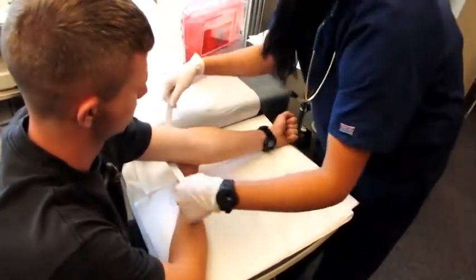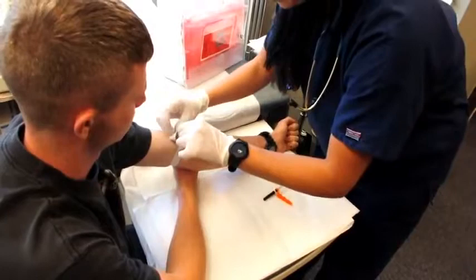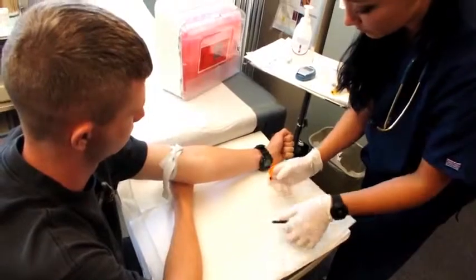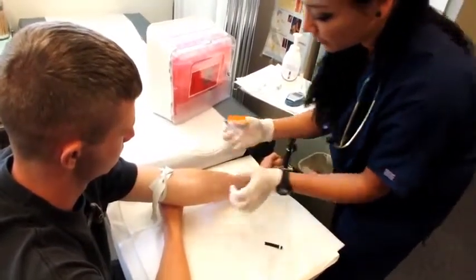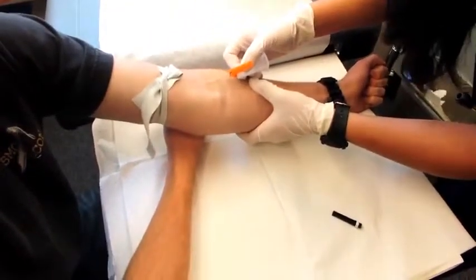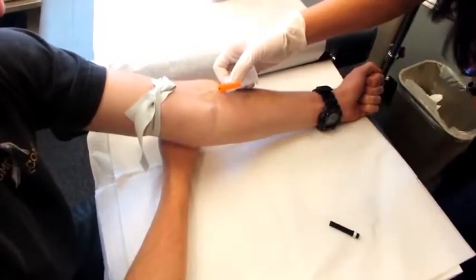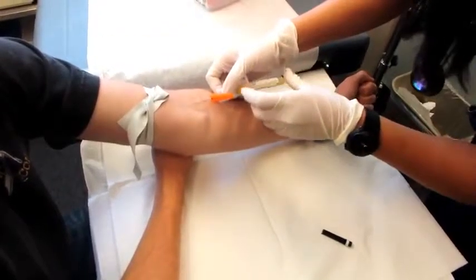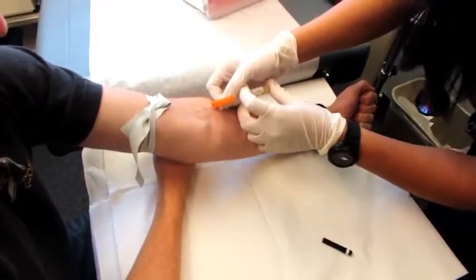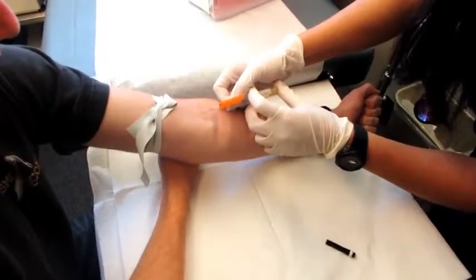Tie a tourniquet, about 4 fingers for the antecubital region. Okay. Make sure that the bevel's up. You're going to go down at a 15-degree angle. Stabilize it. Okay. There we go. Good job.